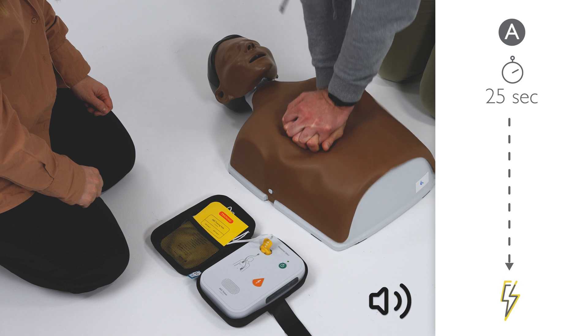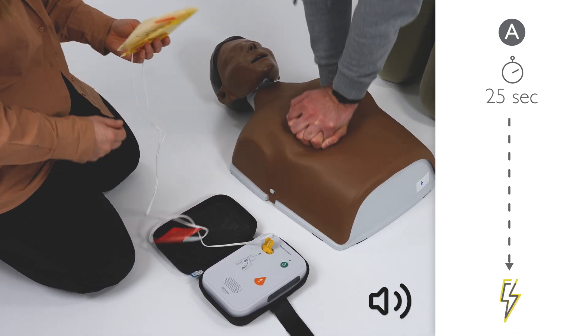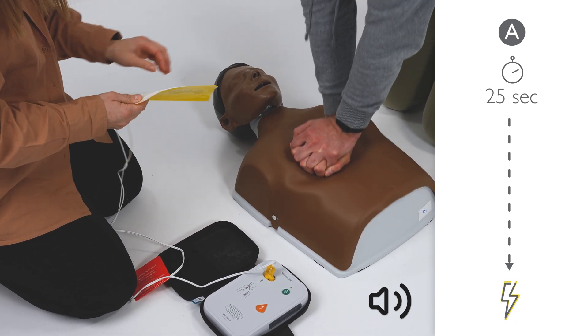Remove clothes from patient's chest. Apply the pads to the patient's bare chest exactly as shown on the pads. Pads must not be touching clothing or each other.